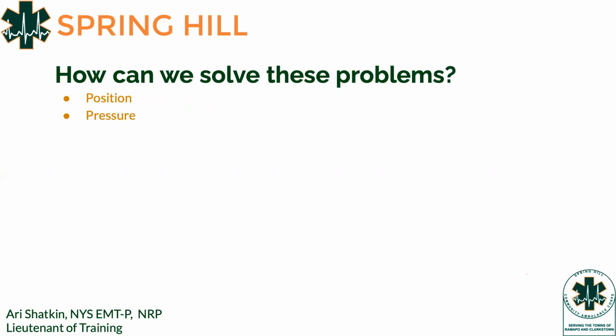So how can we solve these problems? Very simply put, there's two P's: position and pressure. Okay. Usually, a lot of respiratory issues can be caused by just simply changing their position.